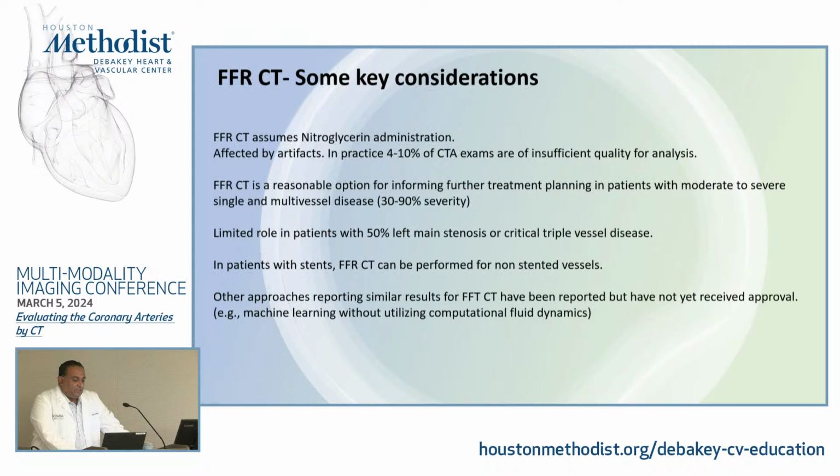So some key considerations of FFR: it assumes that the patients have received nitroglycerin. It's affected by artifacts. So just when we are struggling to read a study and say, oh, I wish I would have information from FFR to break the tie, it comes back as non-diagnostic because the study is just of poor quality. On average, from different studies, 4 to 10% of studies are of not sufficient quality for performance of FFR. It has limited role in 50% left main stenosis or with critical triple vessel disease.